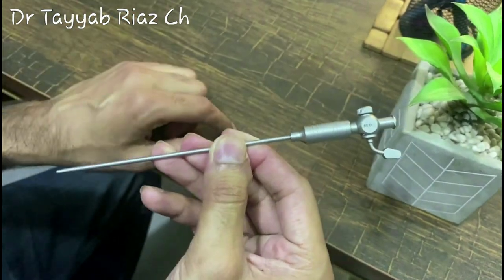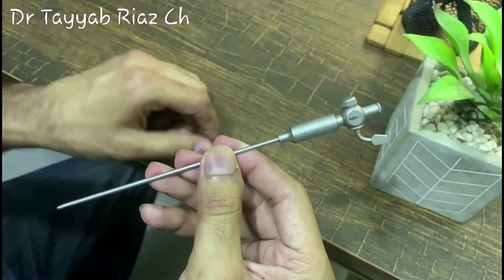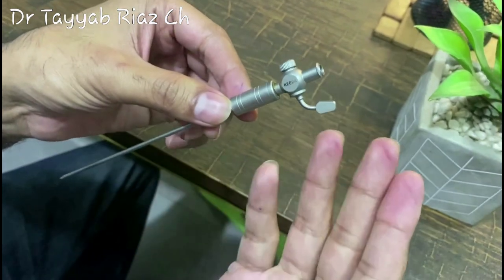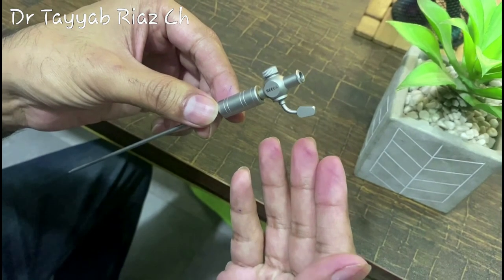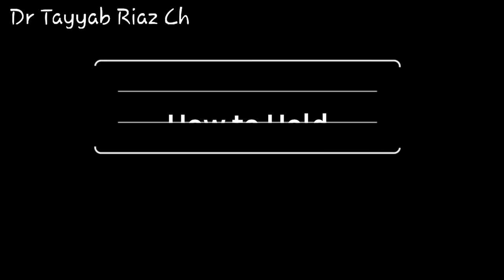And there is another way to know whether you are in the preperitoneal space or in the peritoneal cavity. There are some tests, and those are the irrigation, suction, hanging drop test and the plunger test. And I will demonstrate these tests in the coming clips.